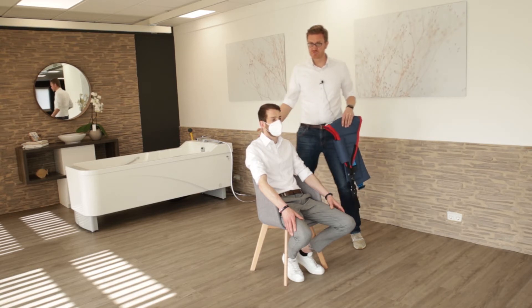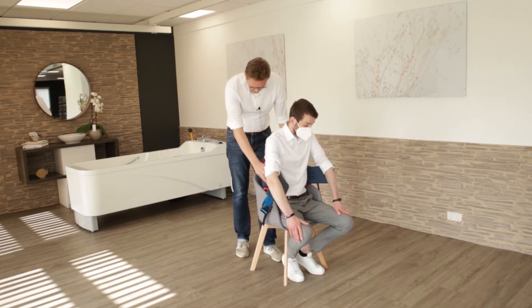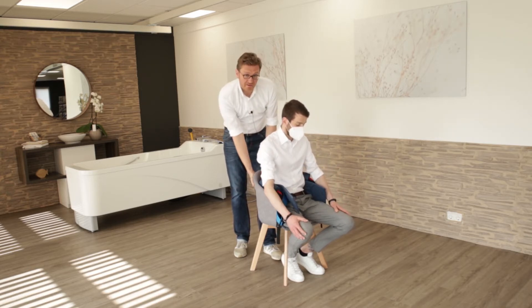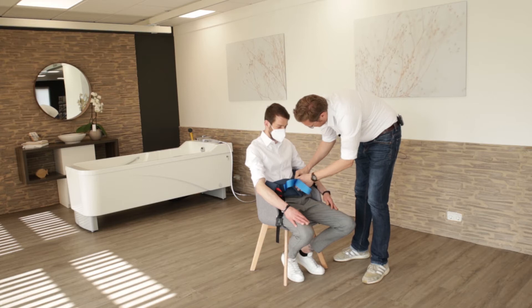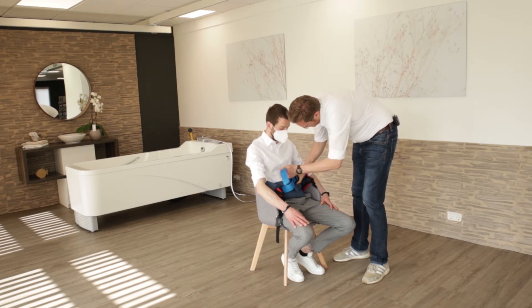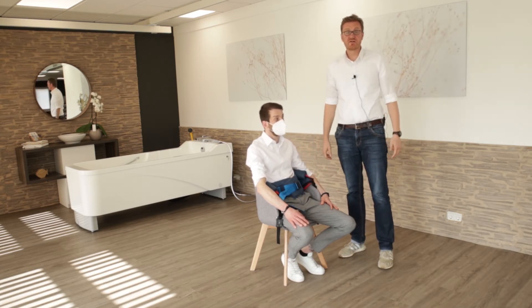We ask the patient to lean a little bit forward if he's able to. And then we position our sling at the lower back, really at the end of the lower back. He can lean back. We adjust the security strap and then we're ready to lift him up.